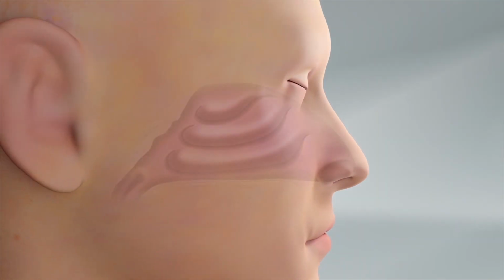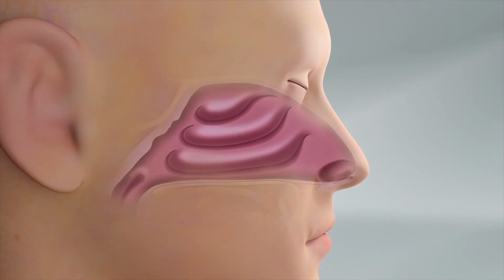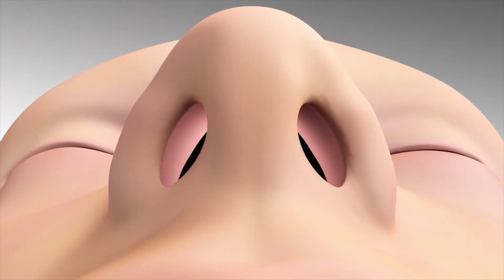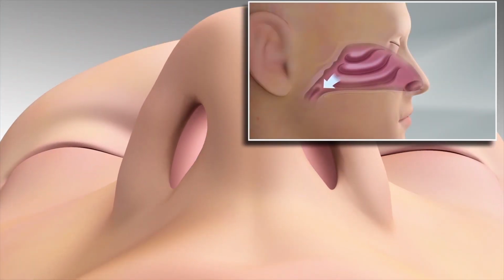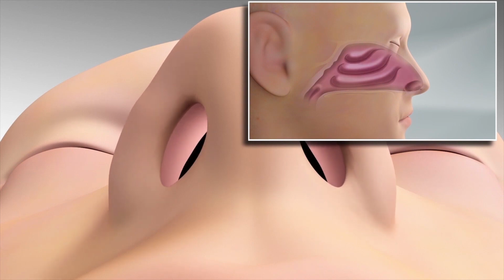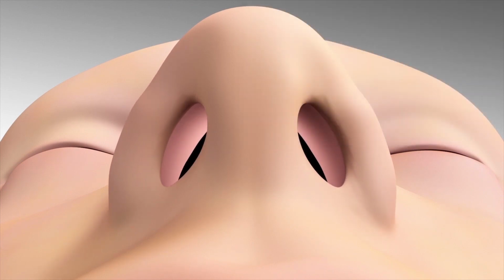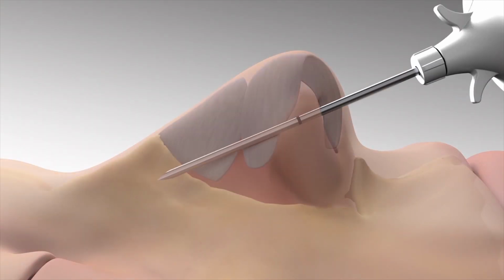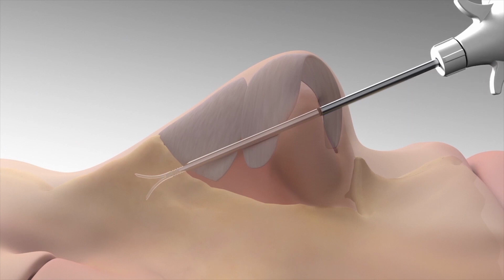Another common cause that we see in our office is a condition called nasal valve collapse, and that's when the sides of the nose can collapse in when you're breathing in. Some people will use Breathe Right strips to help them sleep better at night, but there's a procedure that we can utilize to treat that. Typically, it's a procedure called a lateral implant, where we can place an implant into the nasal cavity. It doesn't change the shape of the nose, but it provides an internal Breathe Right strip to allow you to get better breathing through the nose.